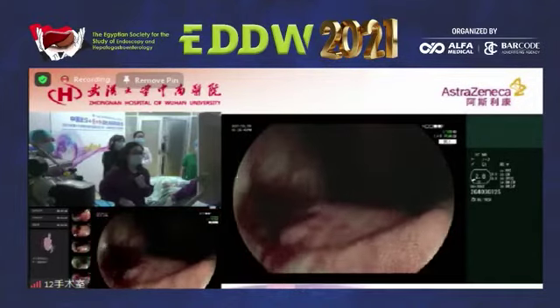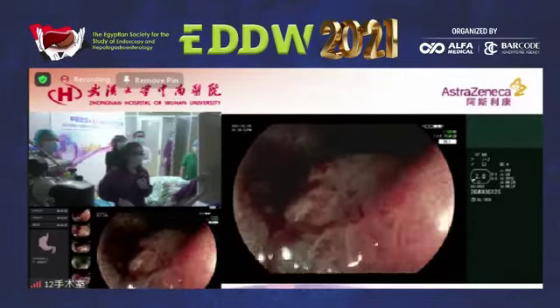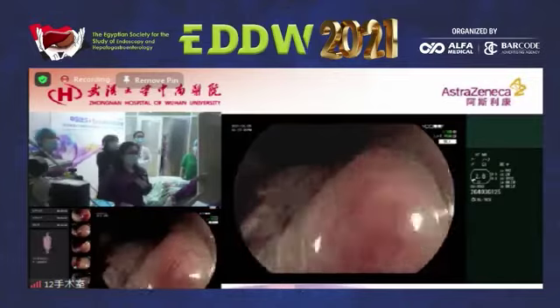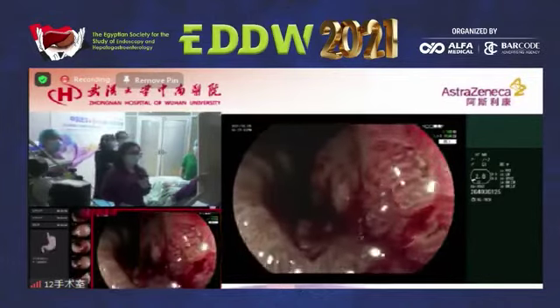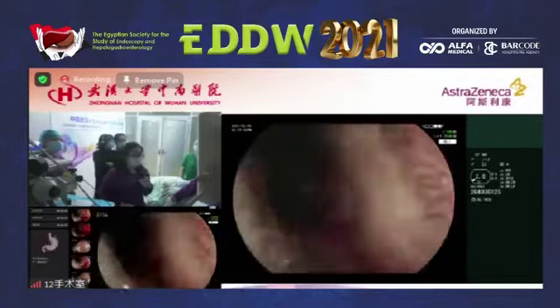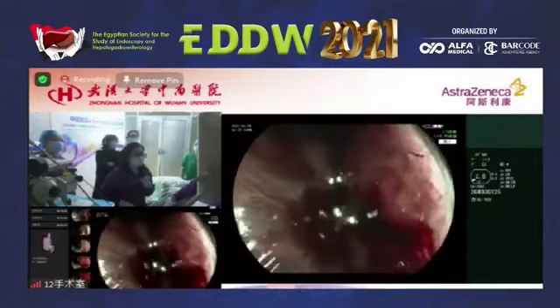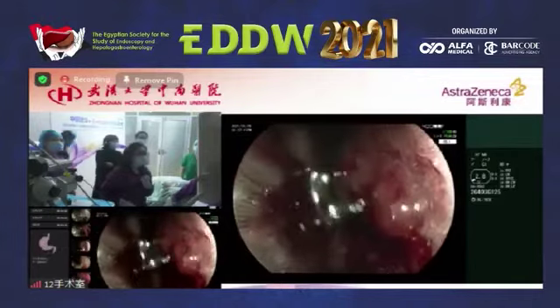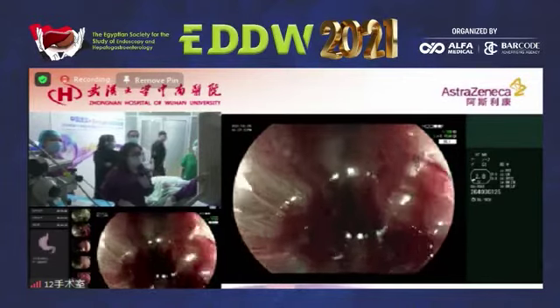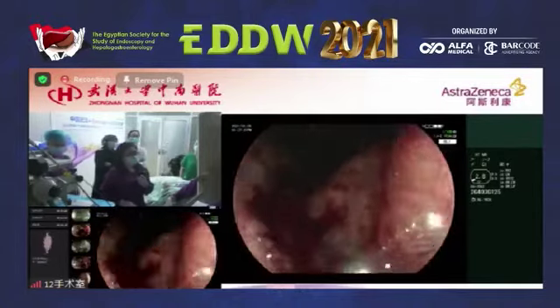Excuse me, please. What have you gained from the use of artificial intelligence here? Are we sure of the nature of this gastric ulcer? I think it's a malignant ulcer. I think it's malignant.